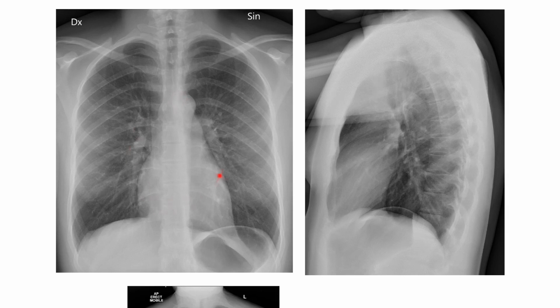This one here is the posterior anterior or PA view, and this one is the lateral view. Typically you're going to get two views because we are turning something that is in 3 dimensions into 2 dimensions, so we're going to need two views to really get the full picture. And so this one is one where you will typically send the patient to radiology to get it done.